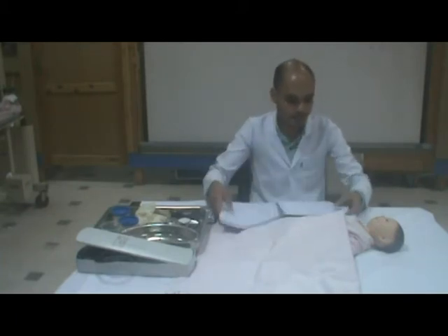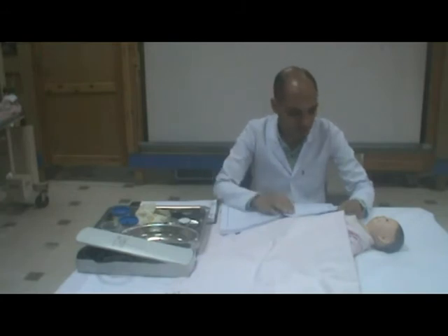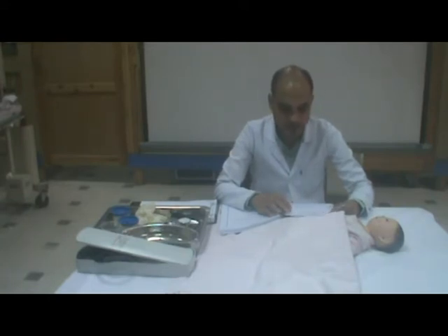The last one, axillary route, from 35.8 to 36.6. Advantages: safe and easily accessible. Avoids the danger of rectal or colon perforation. Avoids initiating the defecation stimulus, often recommended for infants. Disadvantages: value is more readily influenced by environmental temperature and airflow. Requires a relatively long period of time to obtain an accurate reading. Length of time, a full 10 minutes. Suitable age, children less than 6 years.